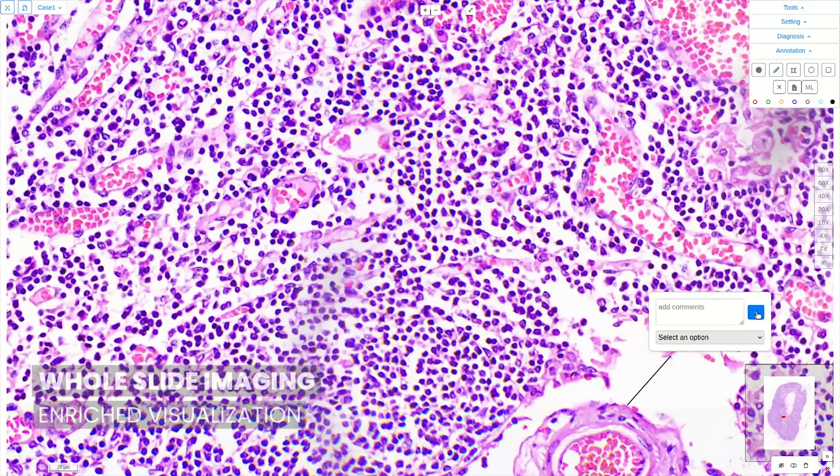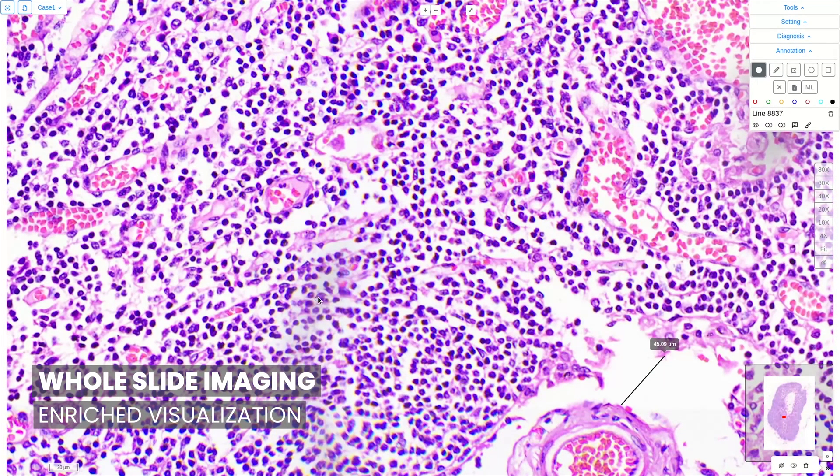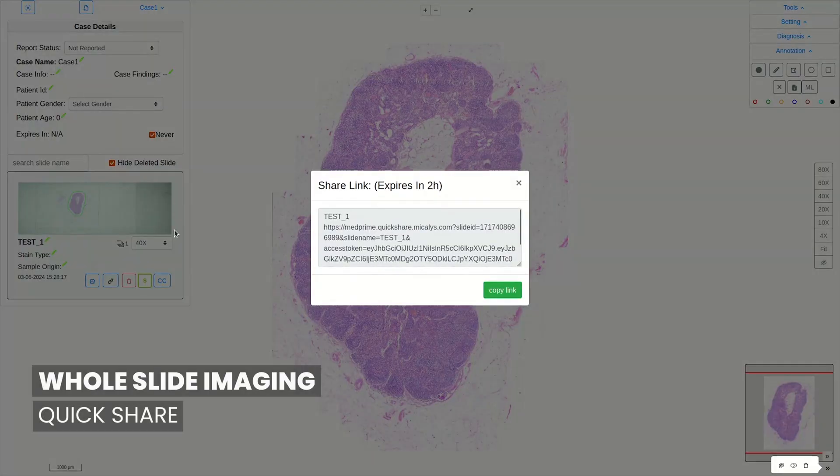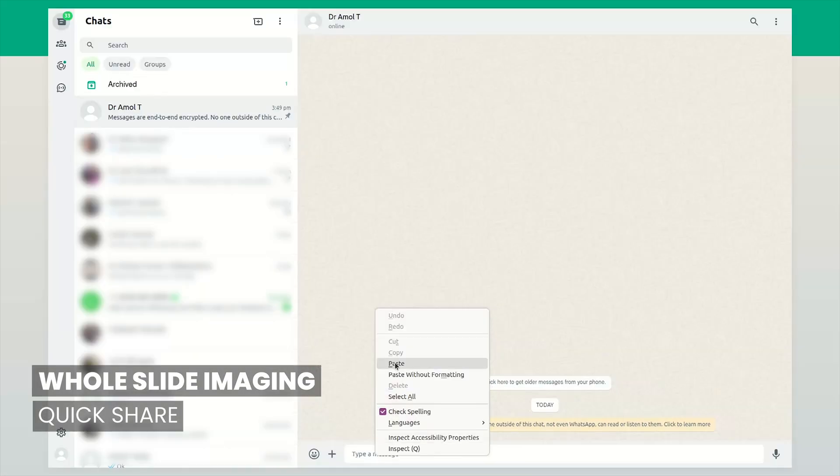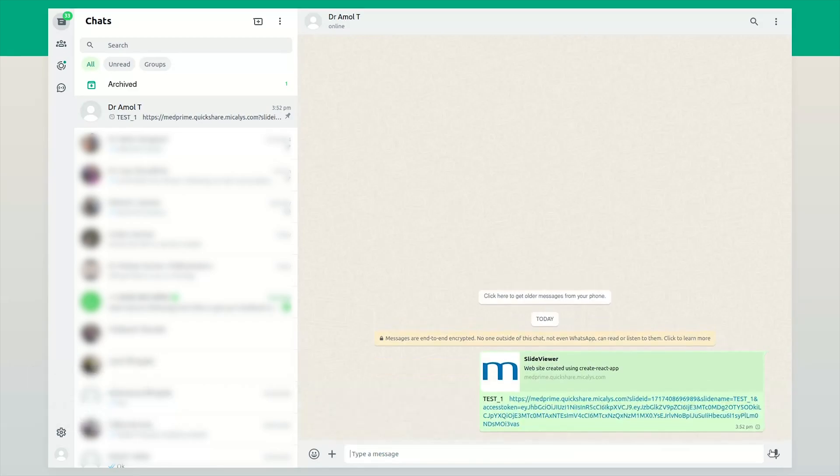Appreciate your slides in a whole new way with enhanced visual features that allow you to explore the details like never before. Share your results securely and effortlessly, ensuring seamless collaboration.